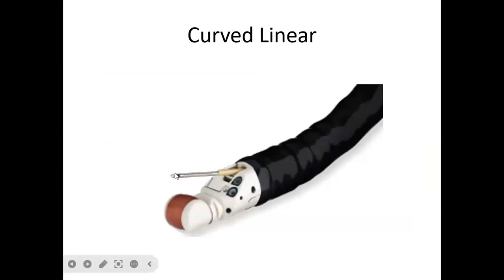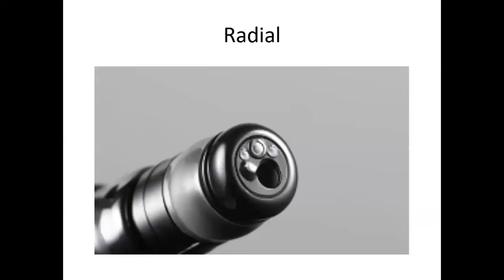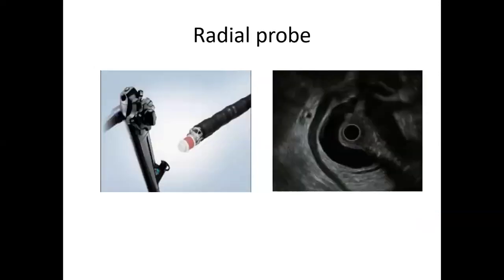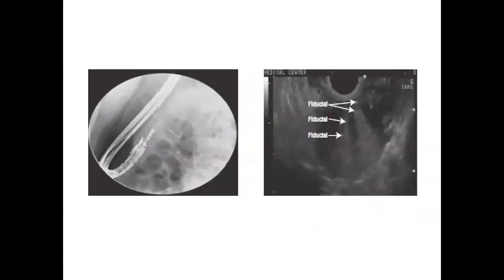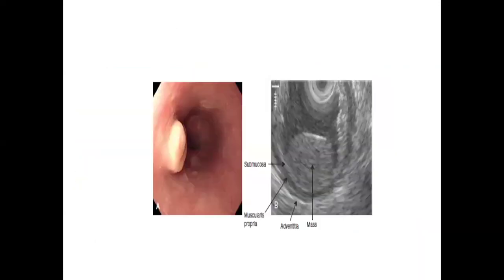Even when we are doing endoscopic mucosal resection, we can push in something like a snare here and we apply the therapeutic approaches. That's why it's loved by a lot of people, because of this extra ability to do procedures. But this other one, we are not able to. That's the difference between these two. So that's why most people prefer a sectorial probe.